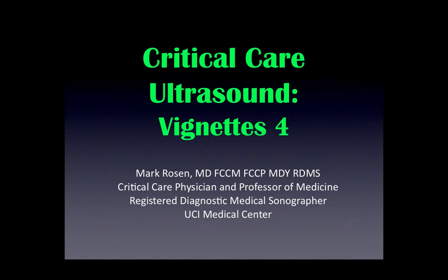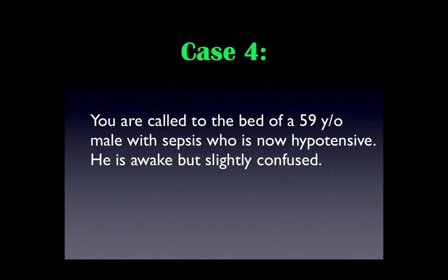This vignette, like all others, is from a real patient and serves to illustrate how ultrasonography can be useful in the intensive care unit or the emergency department in making clinical decisions and diagnoses. In case number 4, you're called to the bed of a 59-year-old with sepsis who is now hypotensive. He's awake but slightly confused.